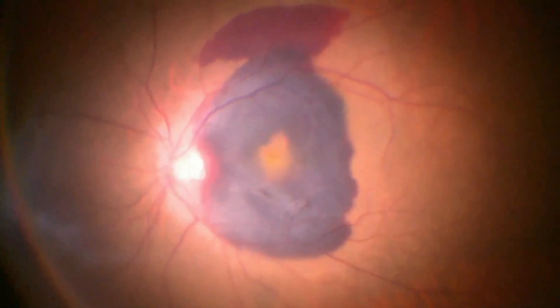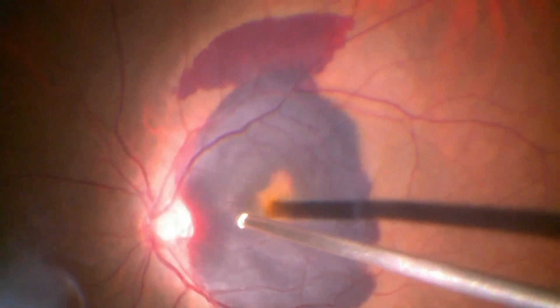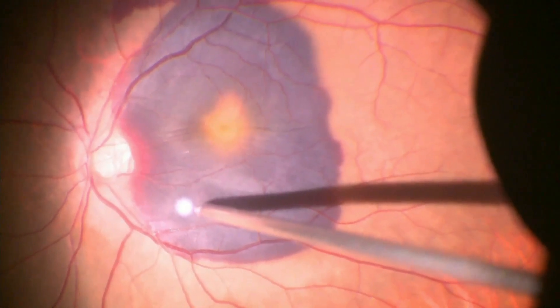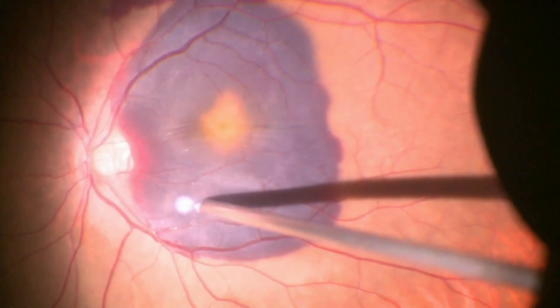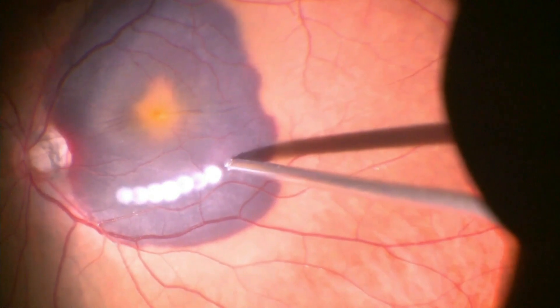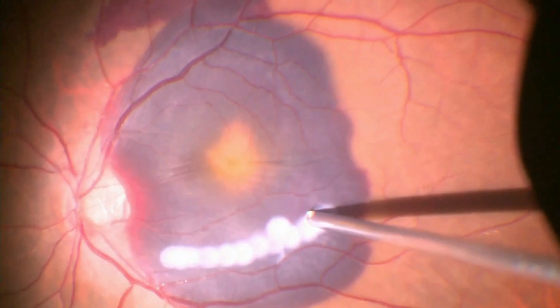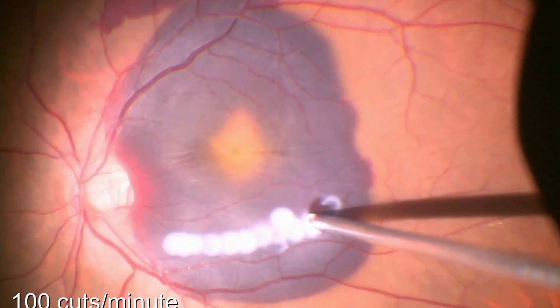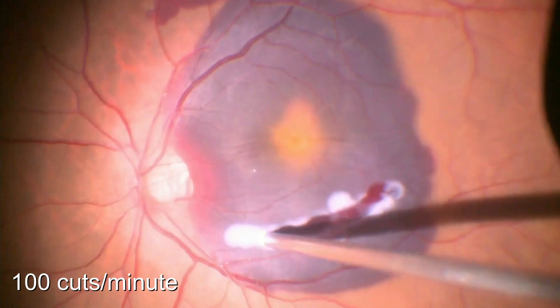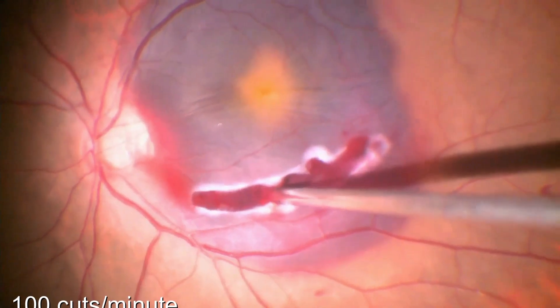In this case, a thorough vitrectomy with PVD induction is carried out, and after that, diathermy is done on the proposed incision site. The cutter is then used to make the incision. Note that the cut rate is reduced to 100 cuts per minute to give a scissor-like control.